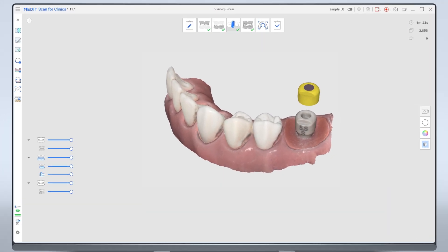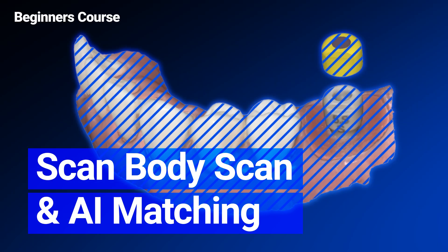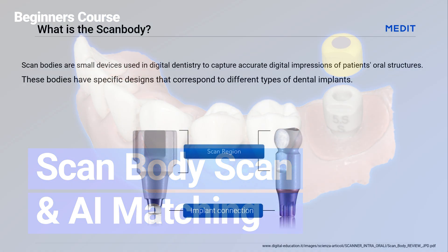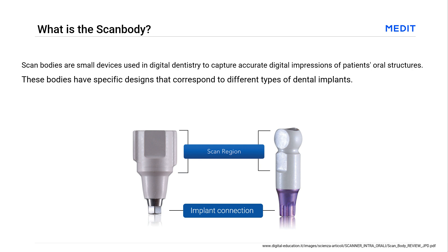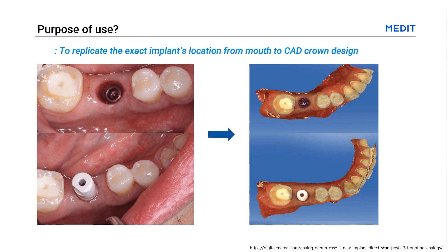This is a quick demonstration on how to scan the scan body and use AI matching. Scan bodies are small devices used in digital dentistry to capture accurate digital impressions of patients' oral structures. These bodies have specific designs that correspond to different types of dental implants. They are used to replicate the exact implant's location from the patient's mouth to the CAD crown design, just like conventional impression coping.